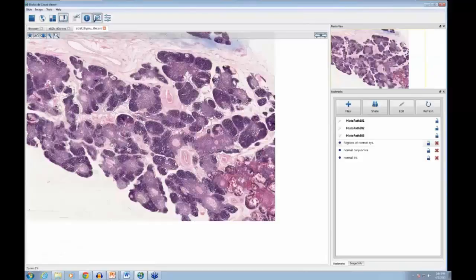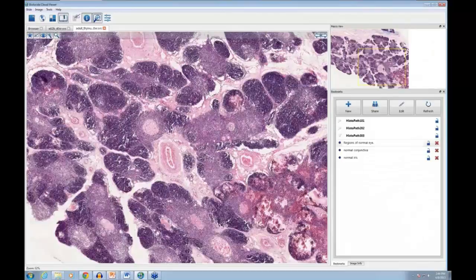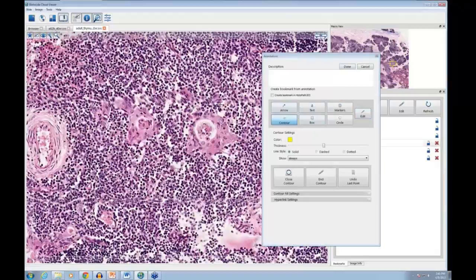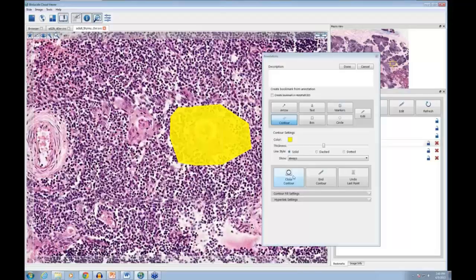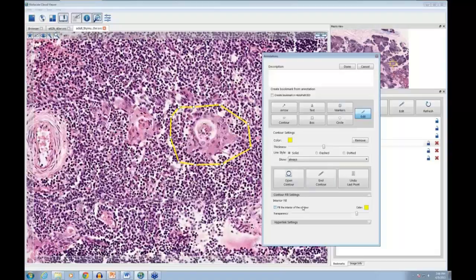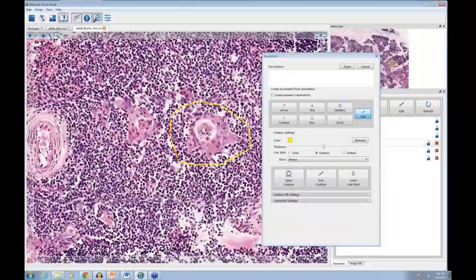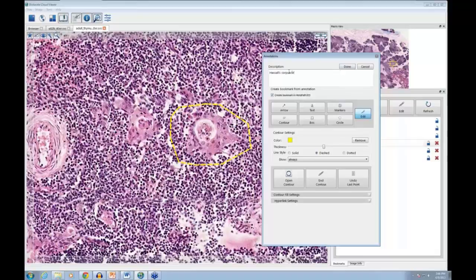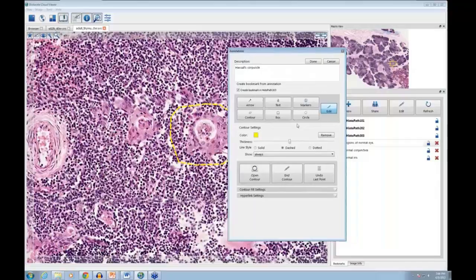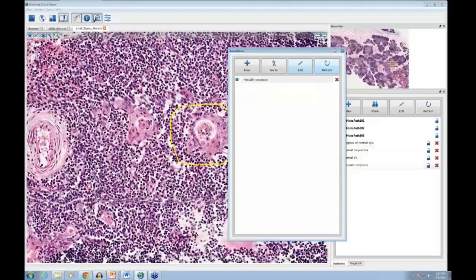Now let me show another annotation tool — drawing a contour around a Hassall's corpuscle. I'll create a contour, then edit it to be not filled and make it dashed, so it outlines the structure more clearly. I'll label it 'Hassall's Corpuscle.' There's also a checkbox to create a bookmark at the same time as you create the annotation, using the description as the bookmark text.